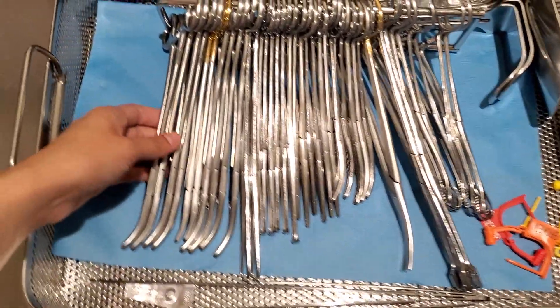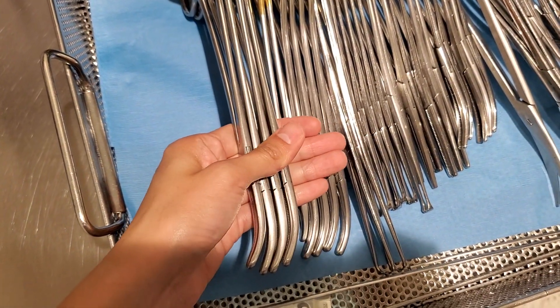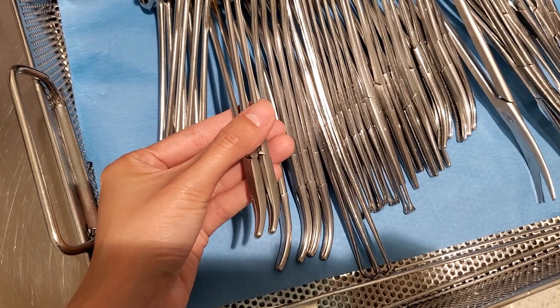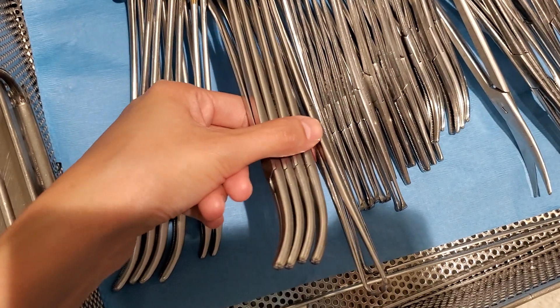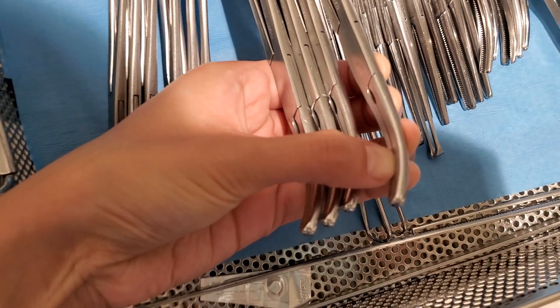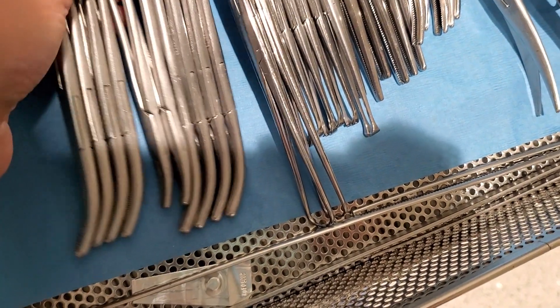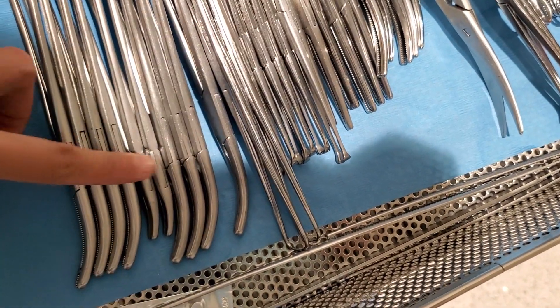So these are curved Haney clamps. These are curved Haney needle holders. Let me see the tip — okay, it looks like they're also curved Haney clamps as well. I don't know why it's like that, but it looks like there's four of them.